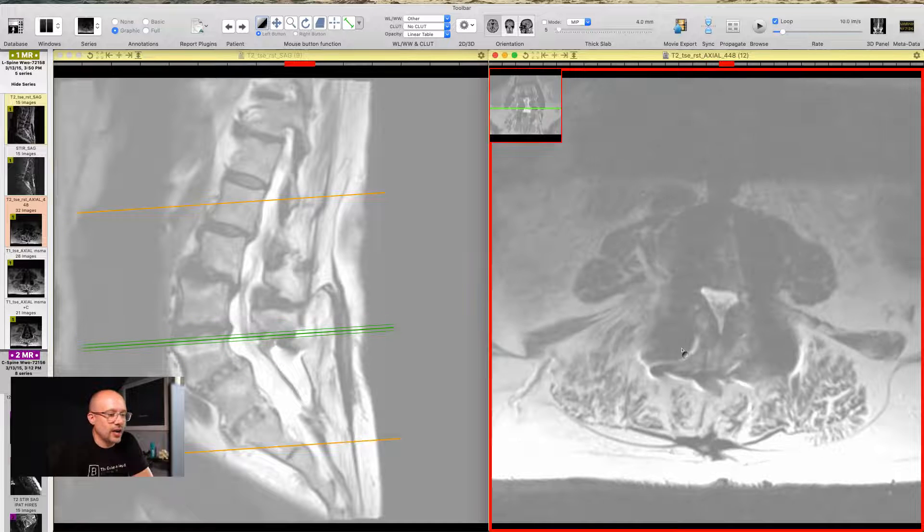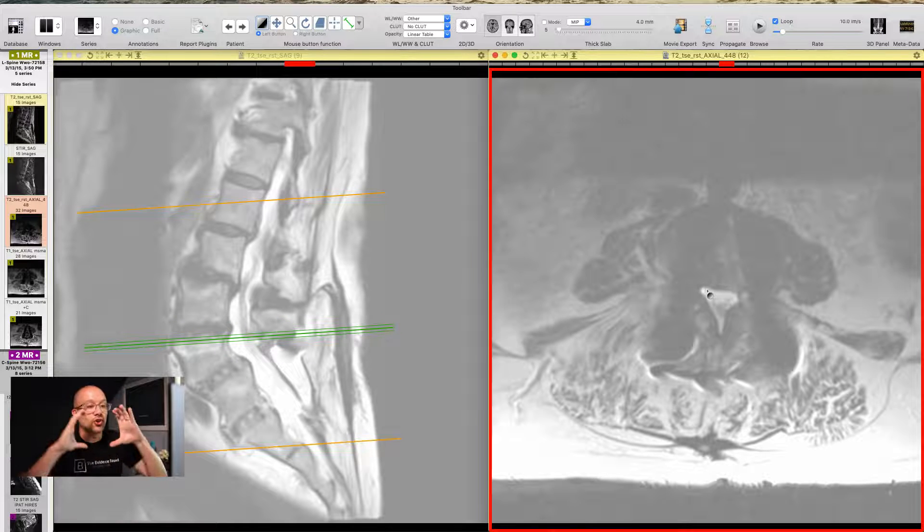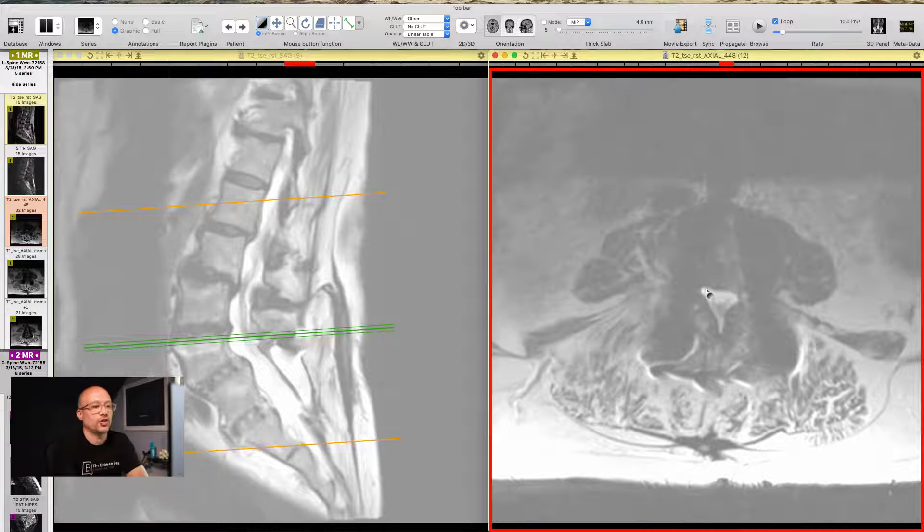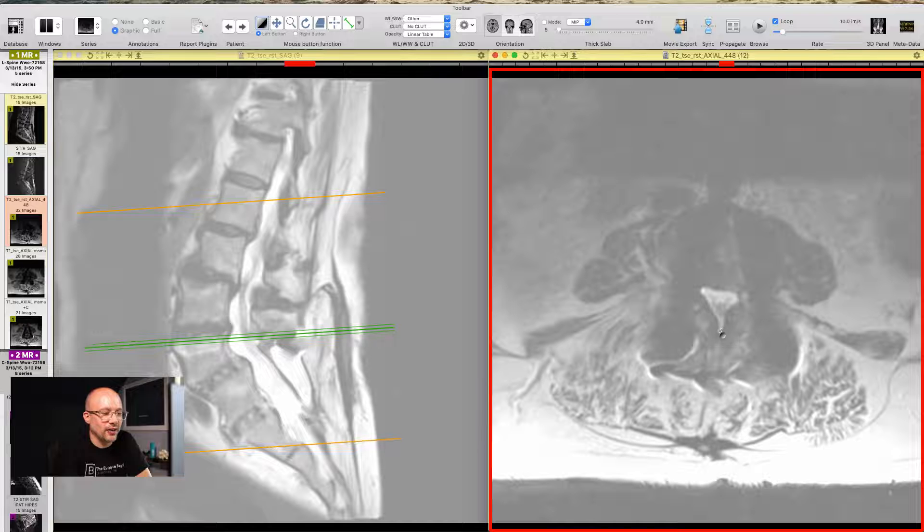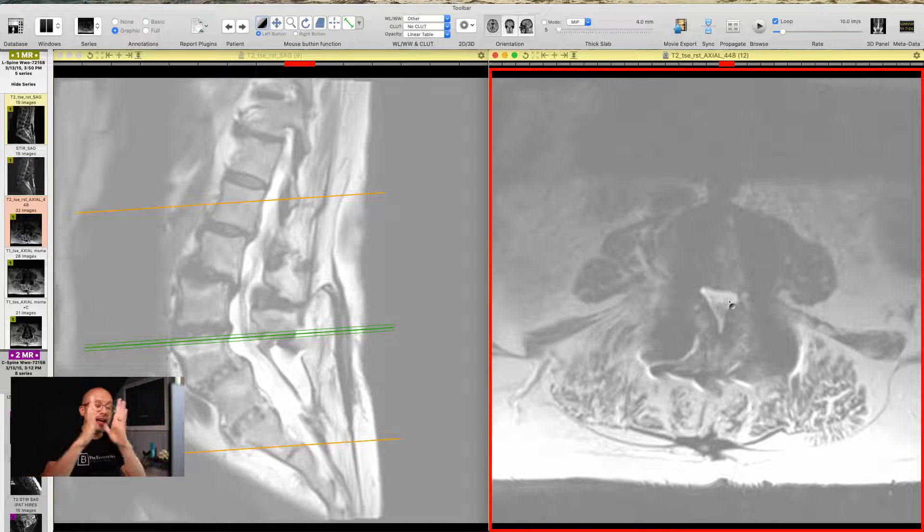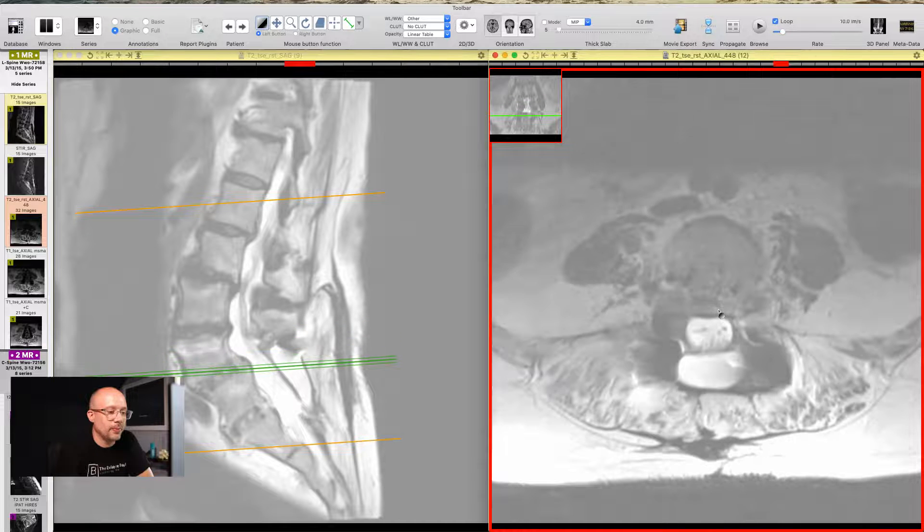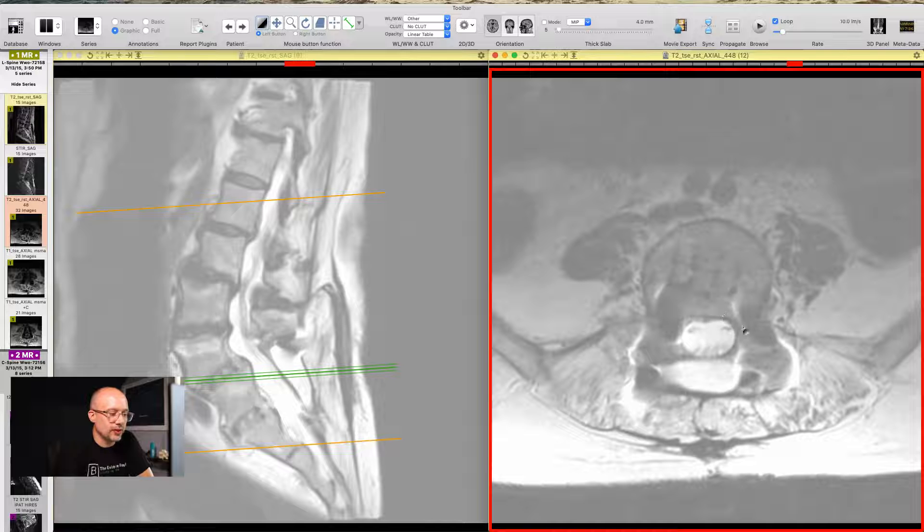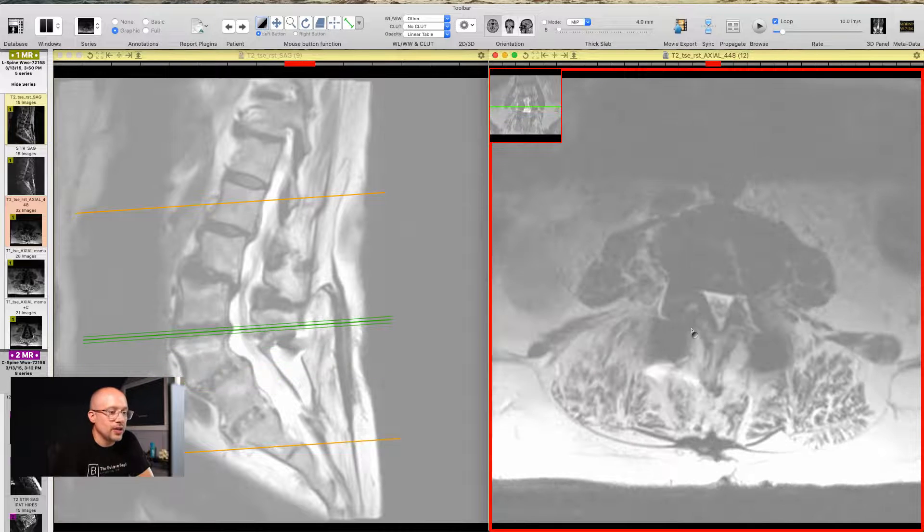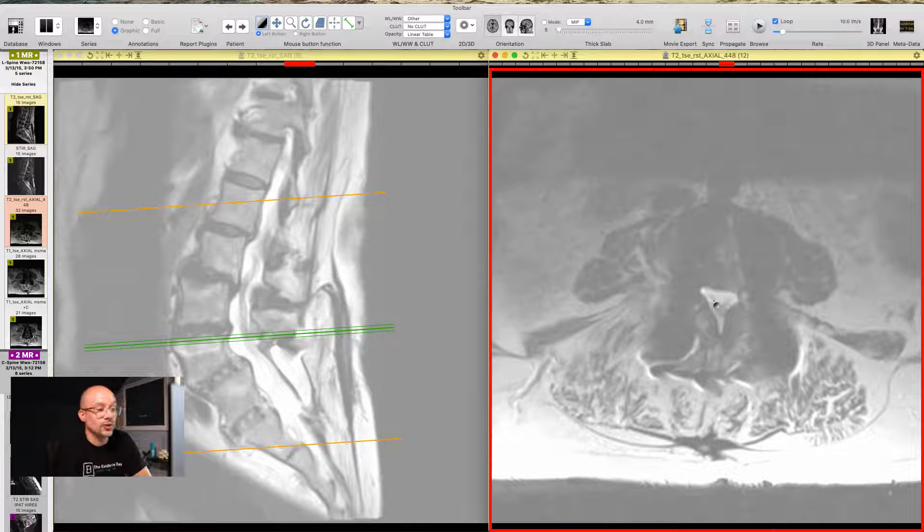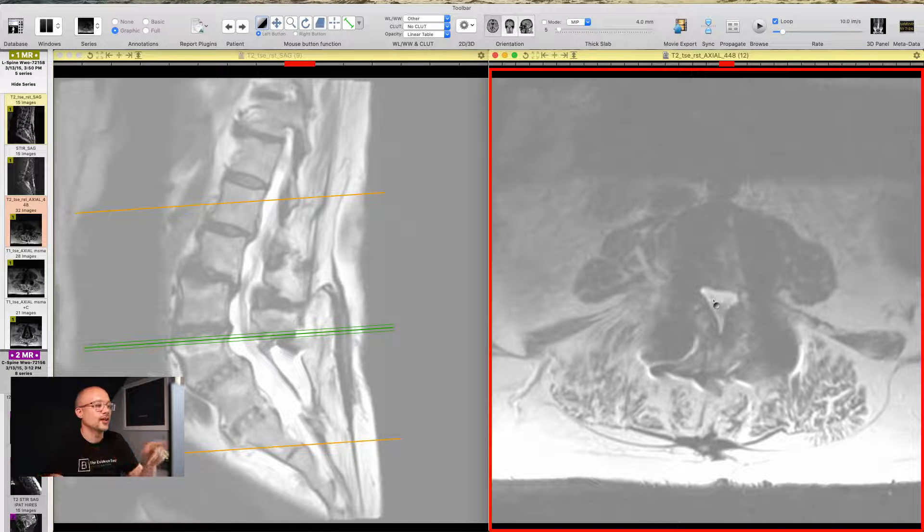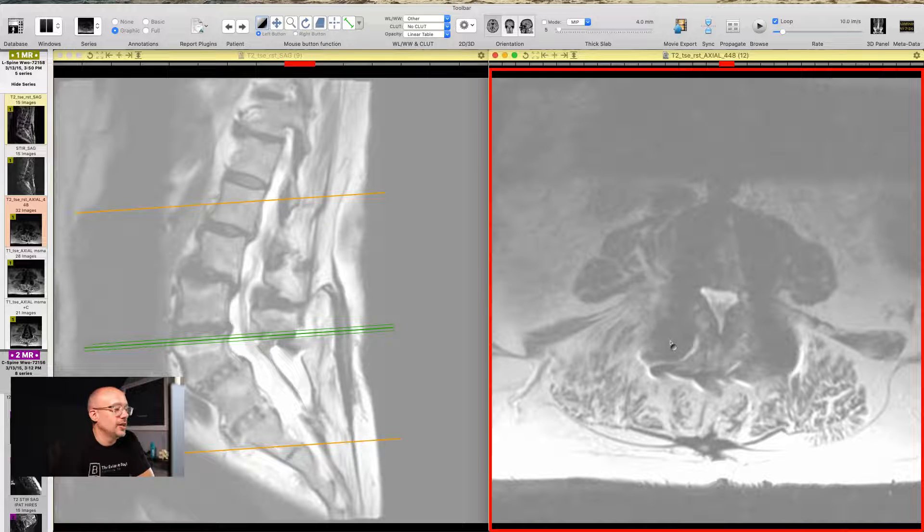Oh boy, now we start to see some challenges. That big open circle that was the spinal canal now has become a very small triangle. Look at this white triangle on the right hand side of the screen. That is stenotic. It's compressed. If we go down, watch it open up to be that huge, big circle down at the next level. If we go up, you can see it crunches right down into a triangle. So there's definitely some stenosis or compression at L3-L4, right above the fusion in this individual.